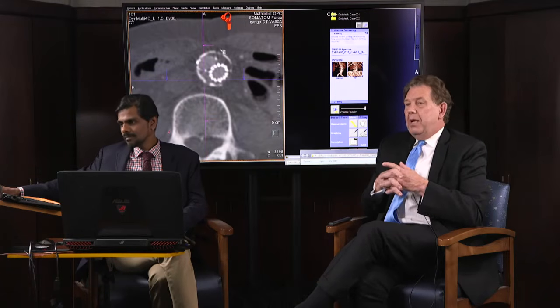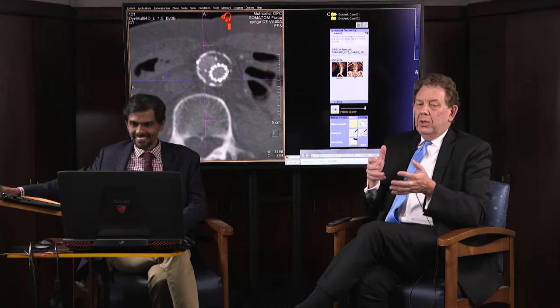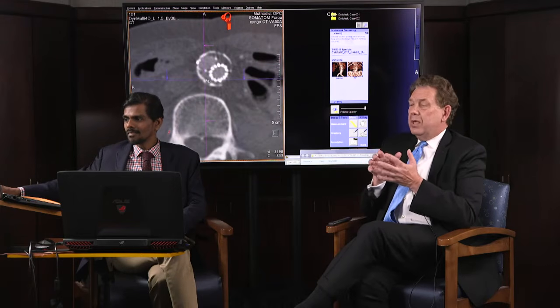They have wall calcifications. As with TAVR, you can see the calcification that Ponraj is pointing out, and we don't need to depend upon that. We don't operate in the ribs, and we don't operate in the spine. We operate in the blood vessels, so we need the blood vessel fusion to be very accurate, and we can do this using multiple different sources.